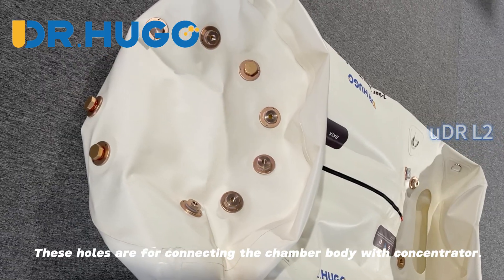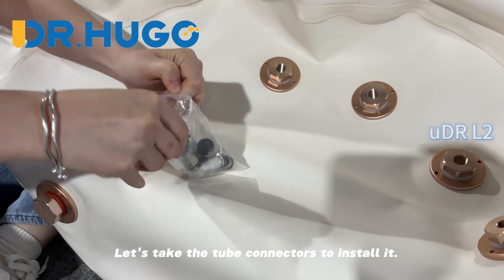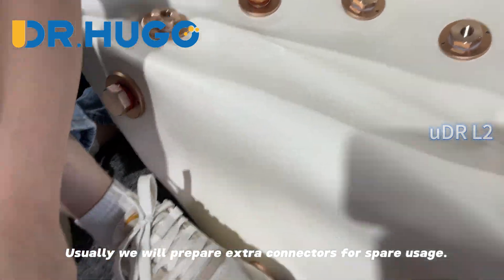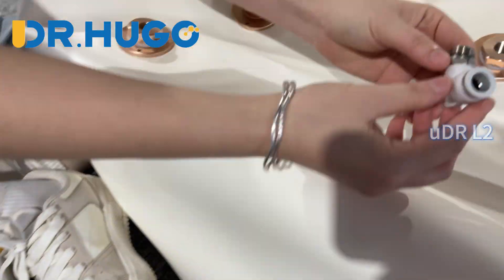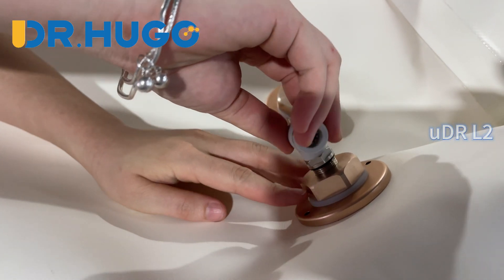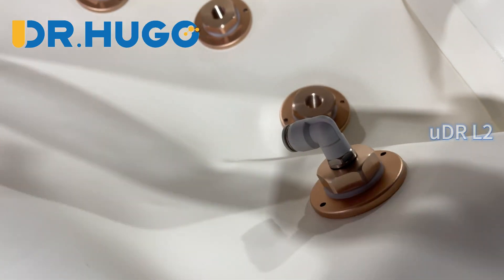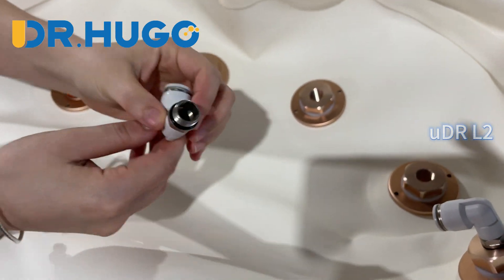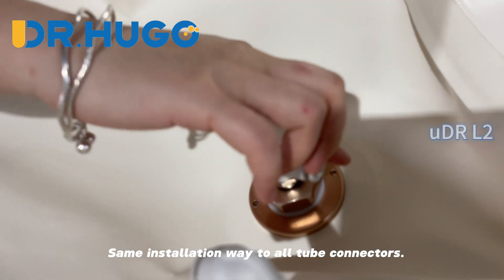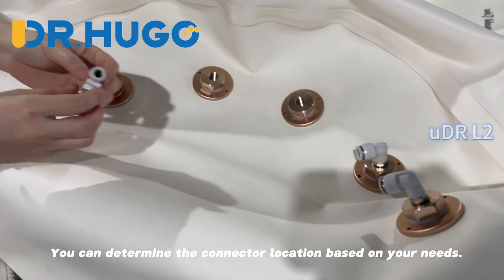These holes are for connecting the chamber body with the concentrator. Let's take the tube connectors to install them. We usually prepare extra connectors for spare usage. We just need to screw it to install — the same installation method applies to all tube connectors. You can determine the connector location based on your needs.